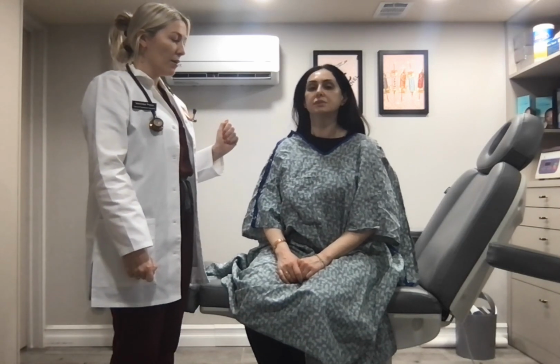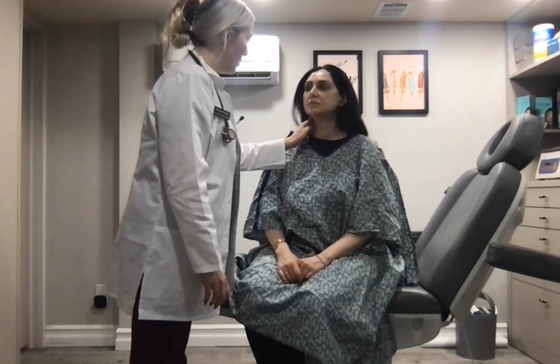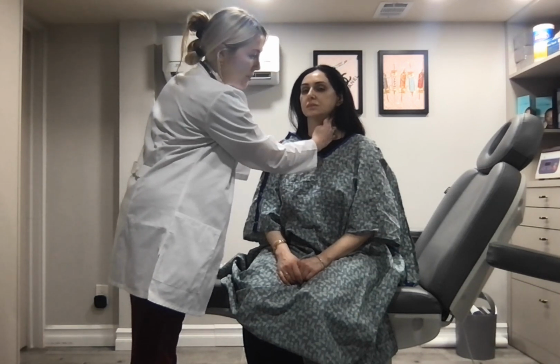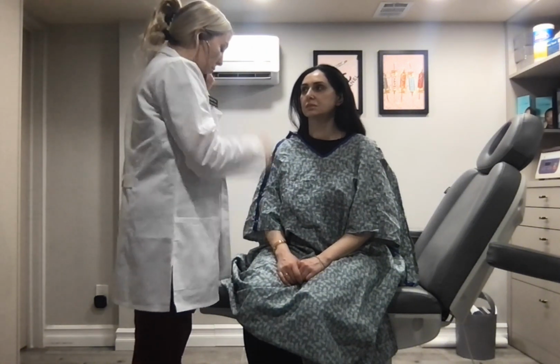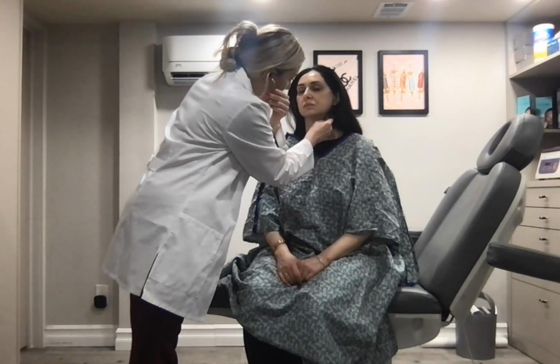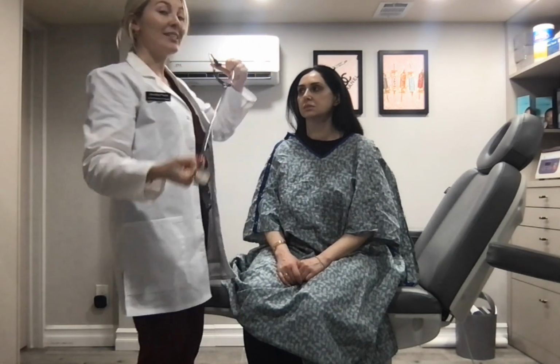So now I'm going to be checking one side at a time because otherwise it can possibly cause fainting, and we do not want to do that. That is nice and strong. On the right as well, it's nice and strong. I'm going to auscultate to make sure there are no bruits. Okay, no bruit present, and I did not feel or hear any thrills at all.